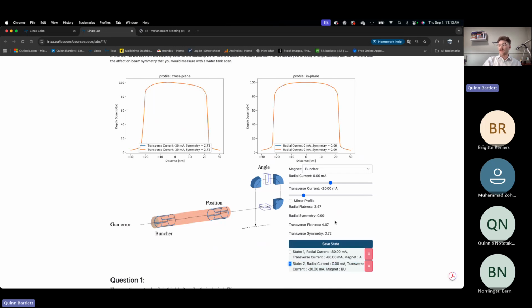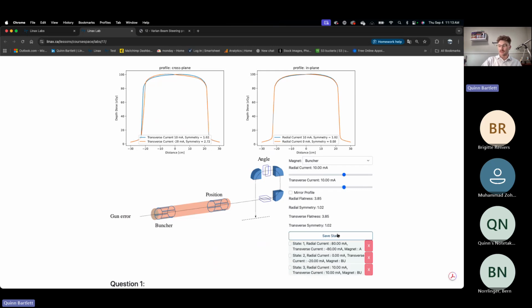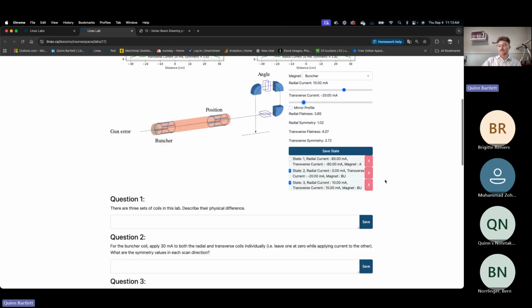As well with this, we do have a save state where you can save this state. You can put it up on there, change the values, see how that affected your output. And again, if you'd like to save that, we can save that and display them both, and then keep changing more and keep saving more. And then there's a set of 10 questions that'll take you through really understanding this phenomena.